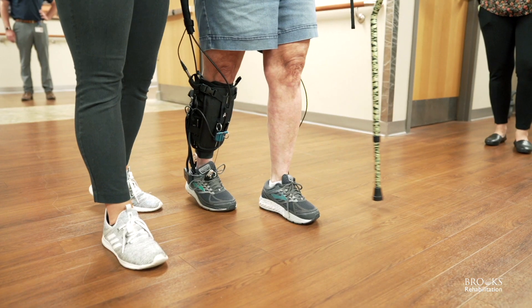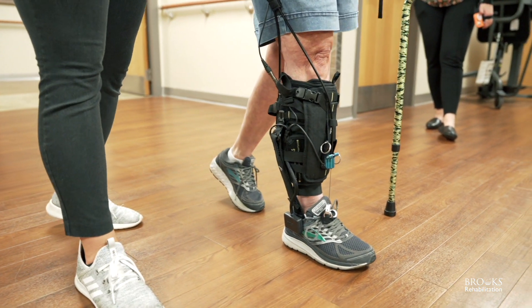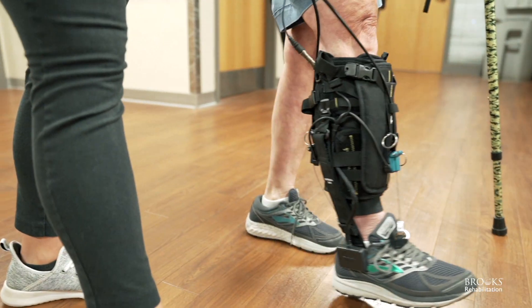At Brooks, we're excited to work with Rewoff. The new product that they've brought to us, the Restore, is one of the first robots out on the market that allows us to work on push-off and gait. That means pushing through your toes and propelling you through an environment, which is the way that we typically walk.